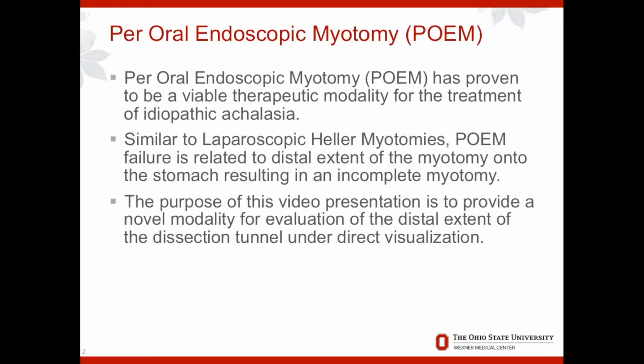Similar to laparoscopic Heller myotomies, POEM failure is related to inadequate extension of the myotomy onto the stomach, resulting in an incomplete myotomy. The purpose of this video presentation is to provide a novel modality for evaluation of the distal extent of the myotomy under direct endoscopic visualization.